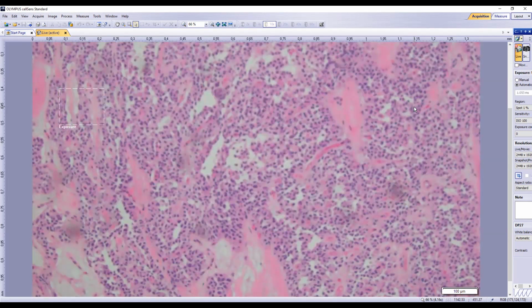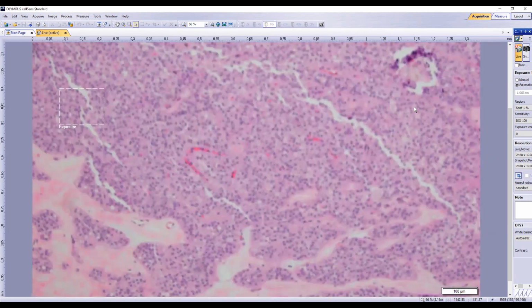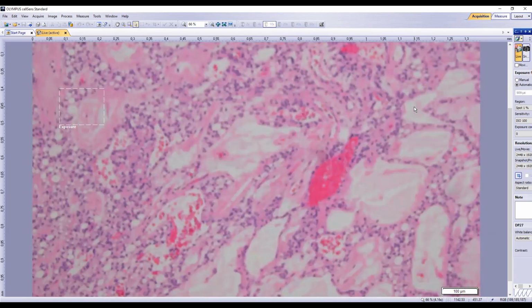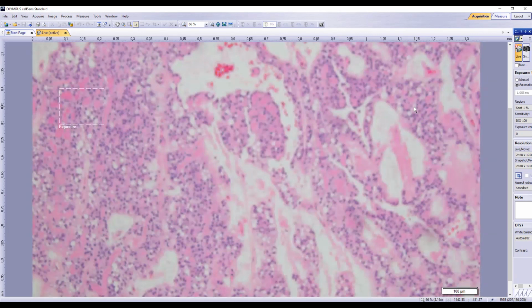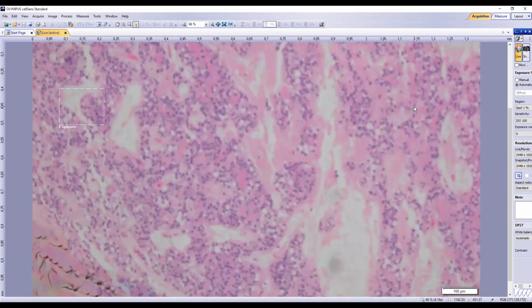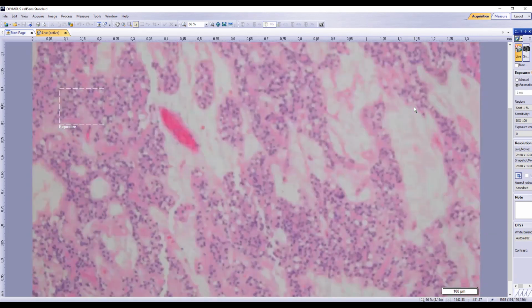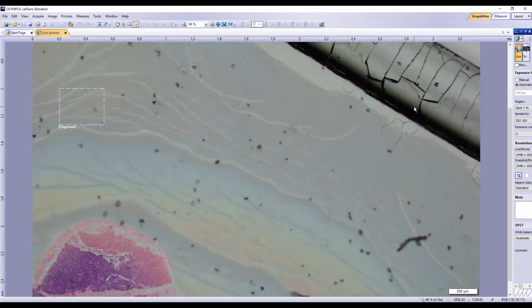No, it can pick up synaptophysin. Sometimes it's patchy. So that's why if you're doing neuroendocrine markers, you should do both chromogranin and synaptophysin. Don't do one and call it neuroendocrine. That's why doing a nuclear beta-catenin will support you.